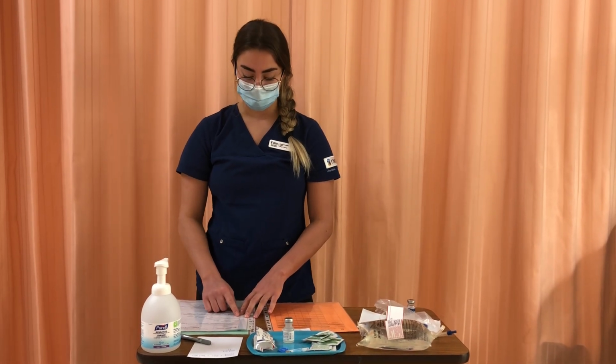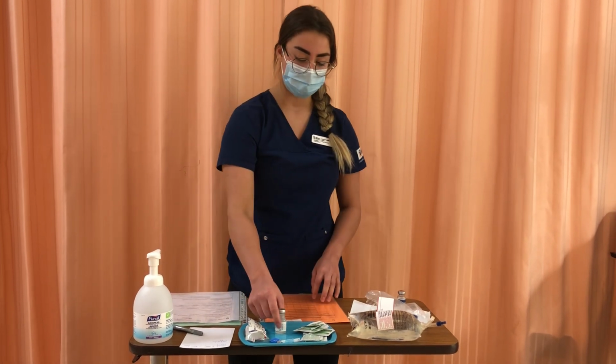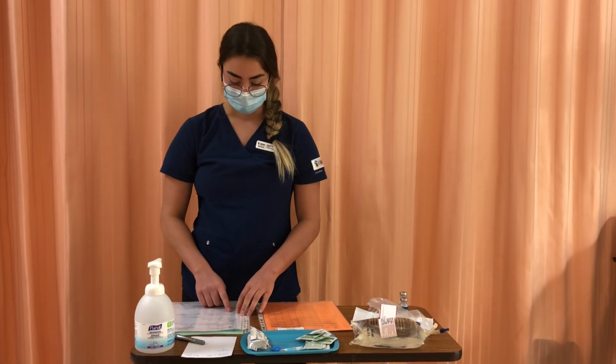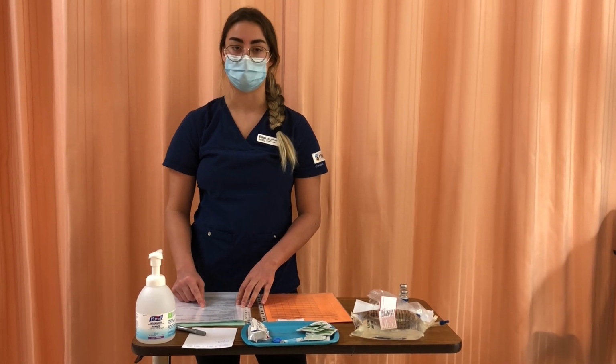So for reconstitution, we're reconstituting with 4.8 milliliters of sterile water for injection. So I'm going to pull my sterile water and make sure it's not expired and that the vial is intact so I can use this. Later we're going to be diluting in 250 to 500 milliliters of normal saline or D5W.